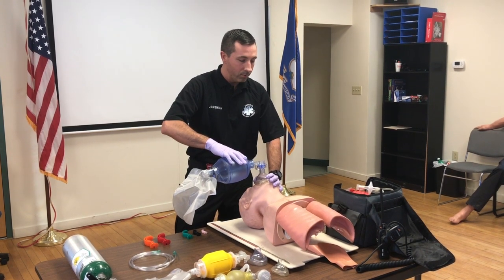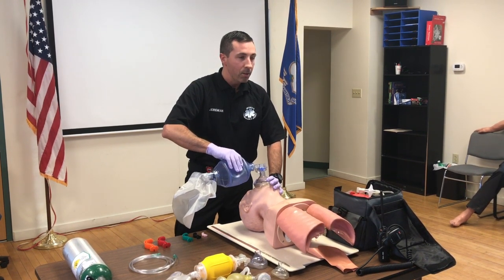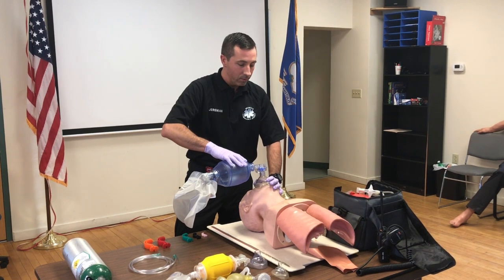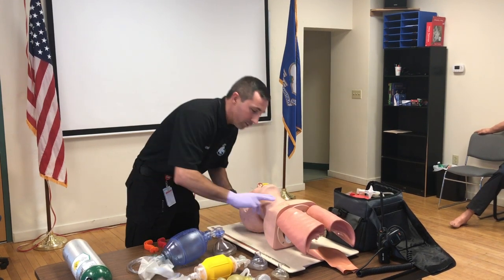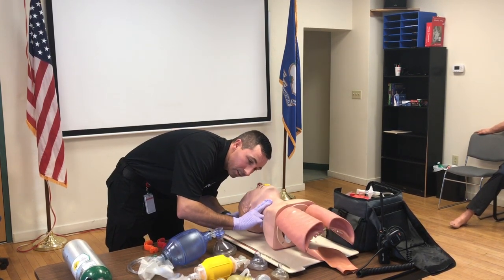I'm now going to reassess for pulse and breathing simultaneously.